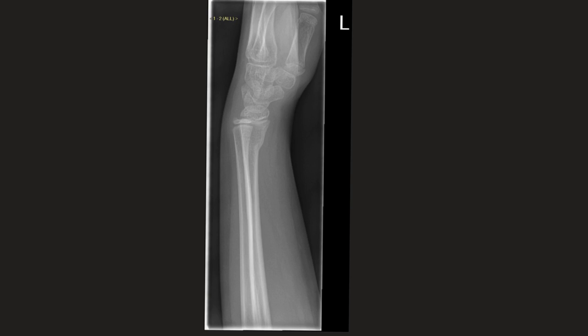Looking closely at this other lateral wrist x-ray, a similar appearance is seen on the anterior cortex of the radius, just here — and here is where the buckle fracture is.